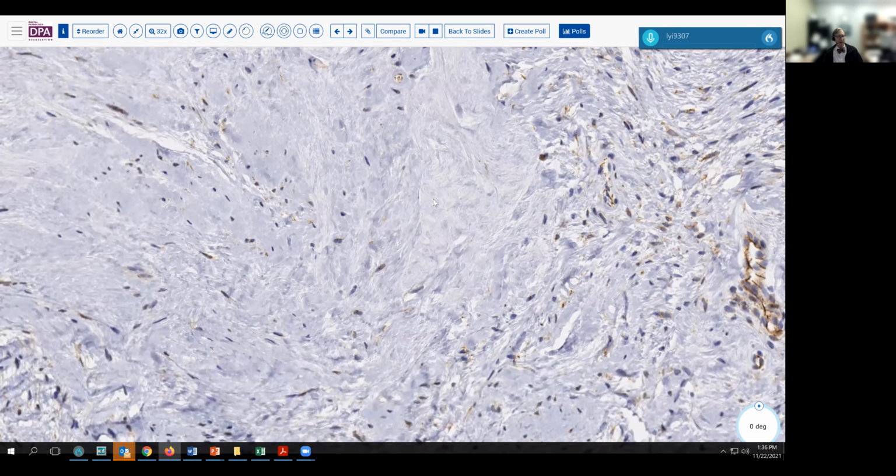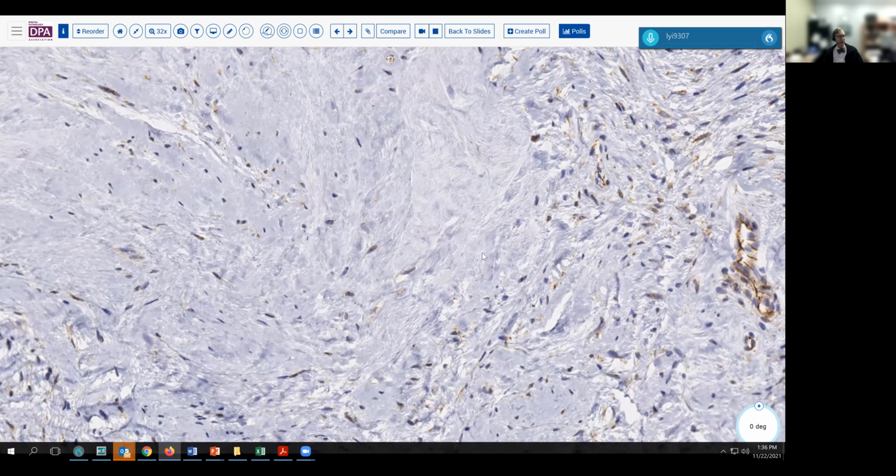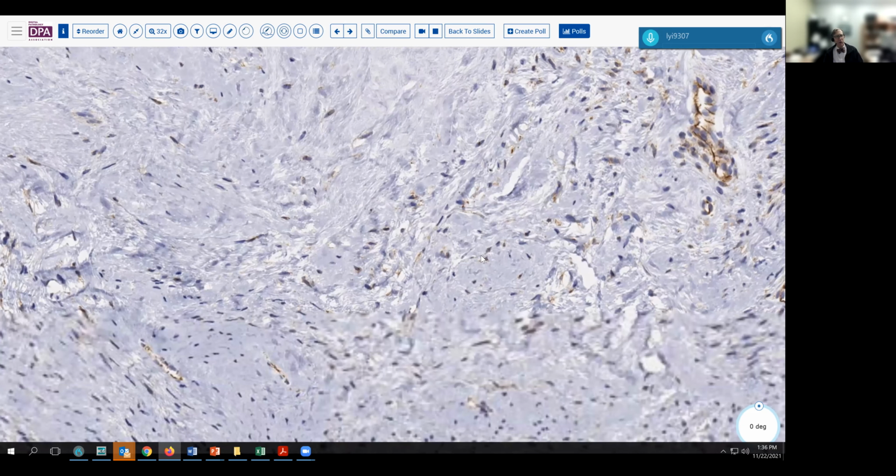Well, in this circumstance, there is a molecular test, of course, that can be done to demonstrate that mutation. And we have used that fairly liberally to help overcome the diagnostic challenges with a beta-catenin stain, as you can see from this slide here, which is a challenge to interpret, I will grant that.